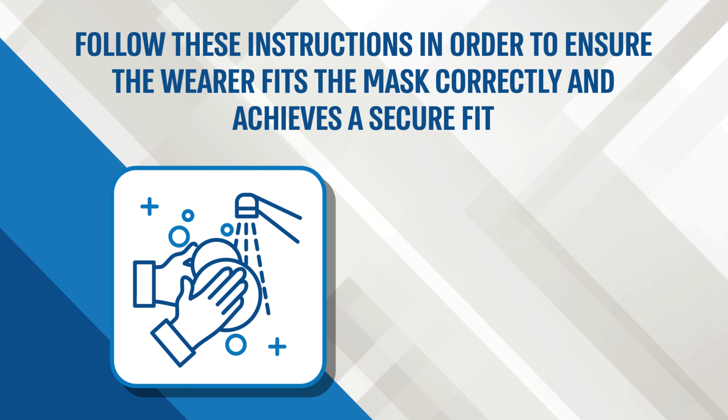Hold the mask with both hands, making sure the Magen logo is on the side facing up. Slightly bend the metal nose piece in the center to prepare it for mounting the mask on the bridge of your nose.